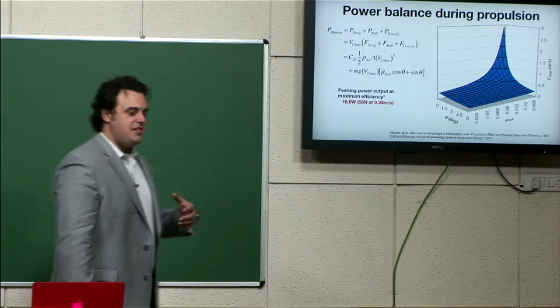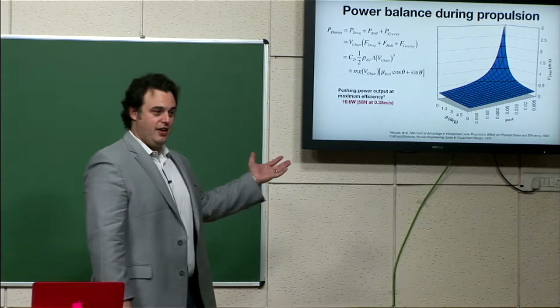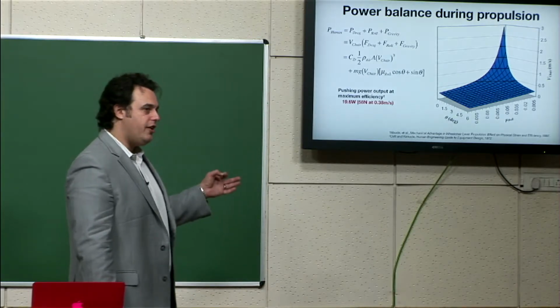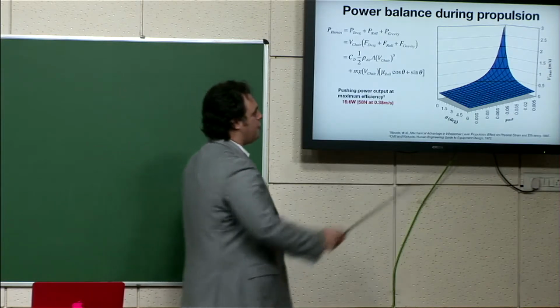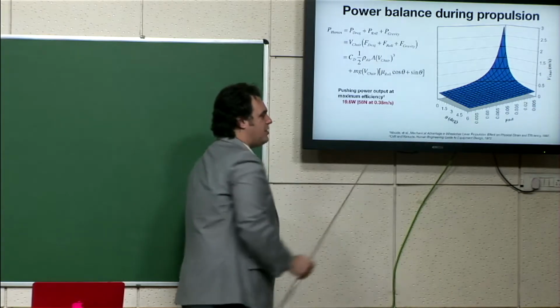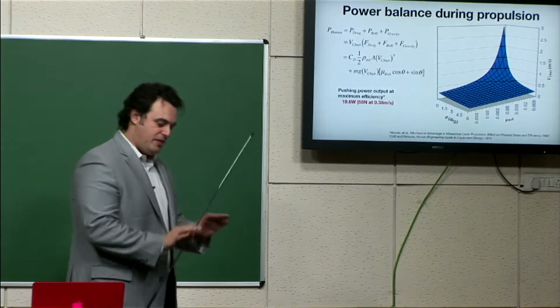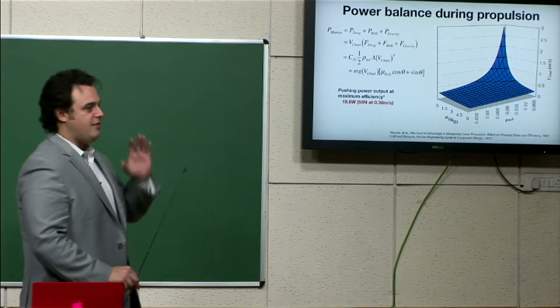So this is a strategy calculation. There's no picture of a wheelchair here. The strategy, there's some picture in your mind of a lever system, but I haven't designed a wheelchair at all here. But I've been able to do a calculation of how fast the wheelchair should be able to move as I change climbing angle and rolling resistance, simply through conservation of energy, right? I don't have a specific drivetrain designed at this point. I'm just saying I have a power source and I have a power sink.